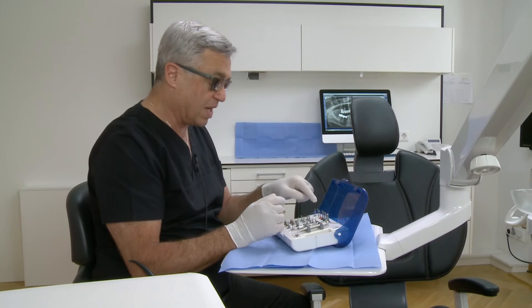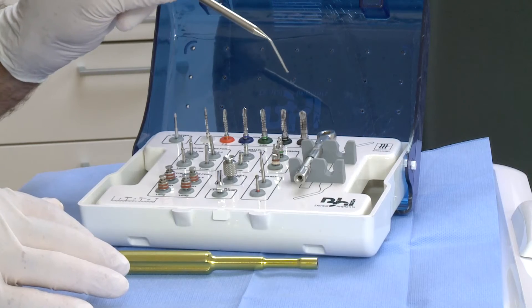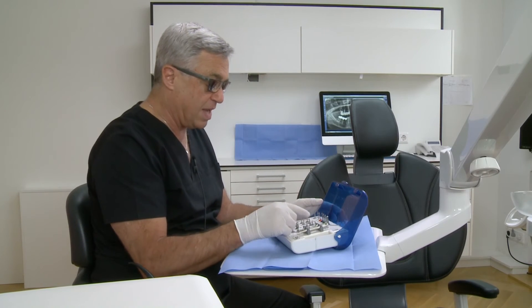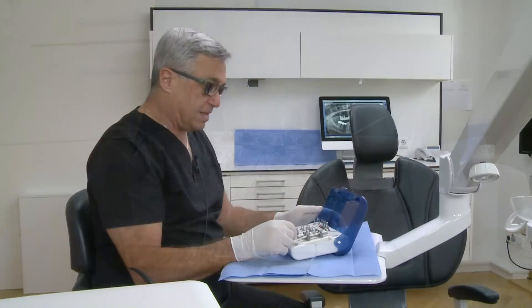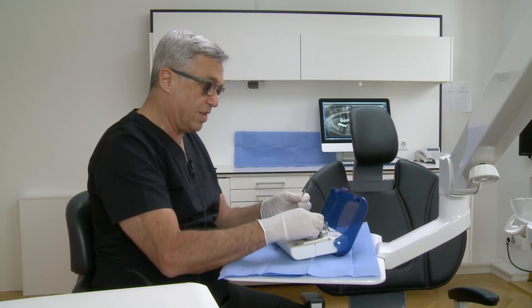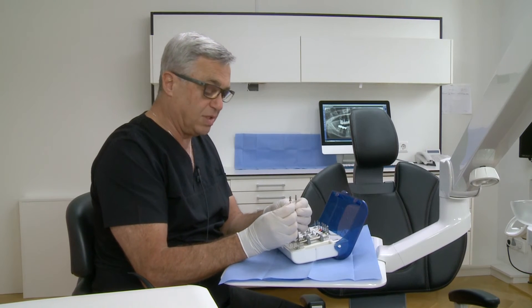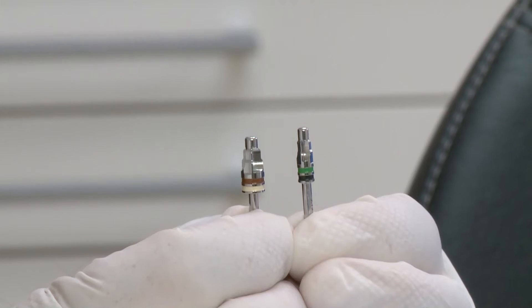The next one is 3.65 mm for a 4.2 mm implant. The next one is 4.2 mm for a 5 mm implant, and 5.2 mm for a 6 mm implant drilling procedure. The next important drills are the countersinking drills for the hard bone. We have them for a 3.7 mm implant and for a 5 mm implant — two of them.